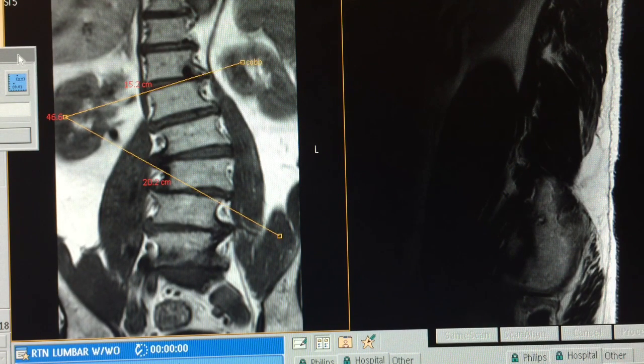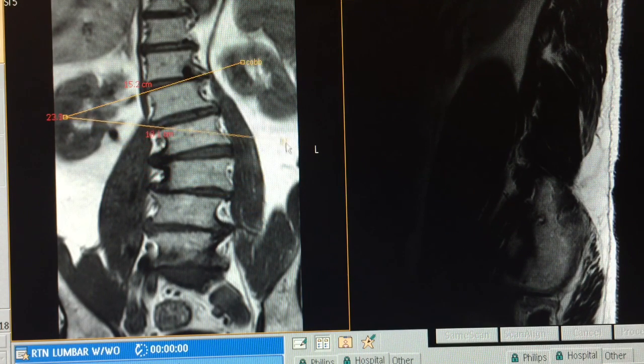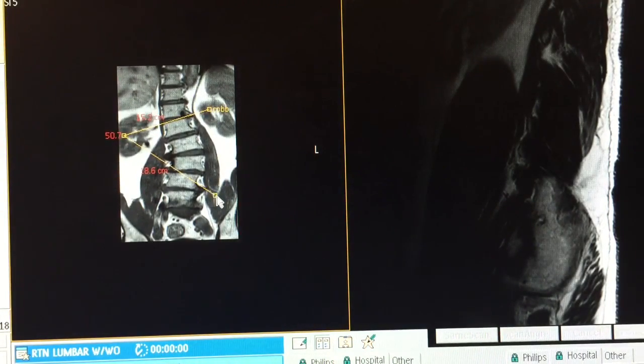We've created this little angle here. Notice the measurement value is displayed — usually it's on the inside, but on Philips it's displayed on the outside. As you change the angle, it will update the measurement for you. Now it's very important to measure it properly, so zoom out so you can extend your lines.